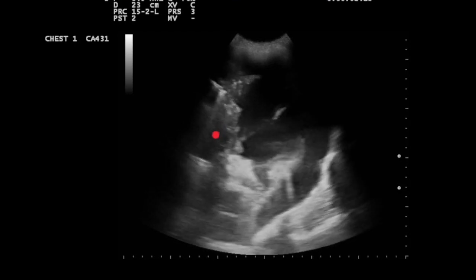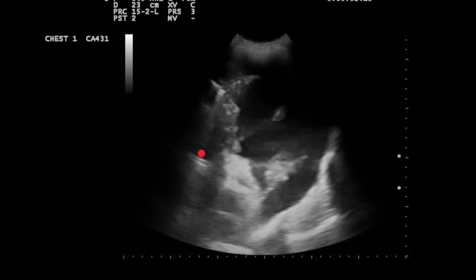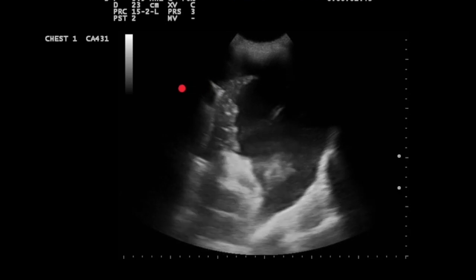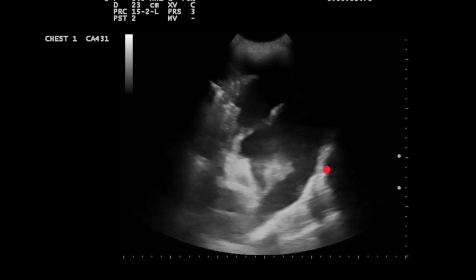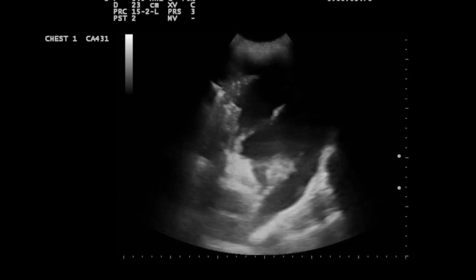Pleural effusions are noted to be very rare, and they're noted to be in intensive care cases only. Here's an example of what that would look like. So you've got lung here, but as you can see the speckling? It's actually got pneumonic changes within it. The black space is all fluid, and this is a diaphragm. But this is a parapneumonic effusion with a pneumonic lung there.